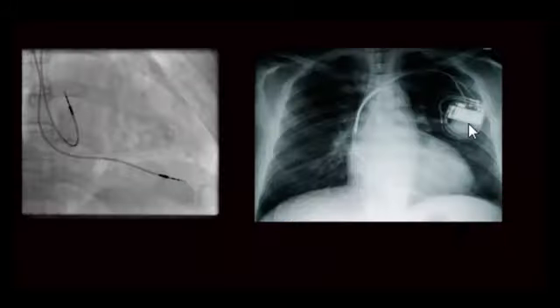There are several questions that people always have when they have a pacemaker. Is this pacemaker going to go off when you are in the airport security check? Yes, the pacemaker is going to signal that there is metal, and you're going to be called to the side. The best thing is to carry your identity card and explain to them that you have a pacemaker, and hopefully they would be courteous enough to recognize this and deal with it appropriately.